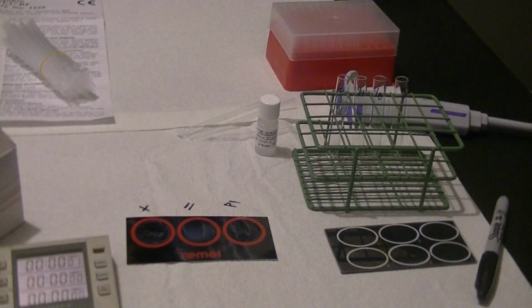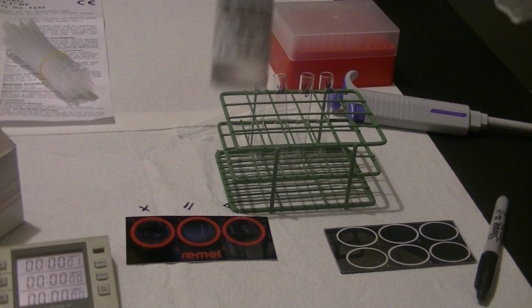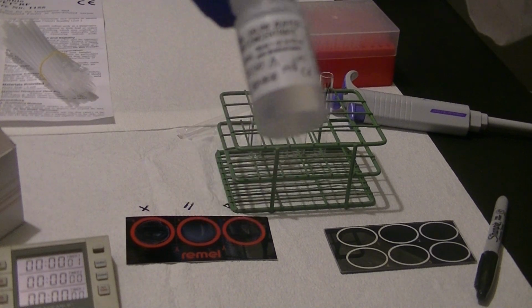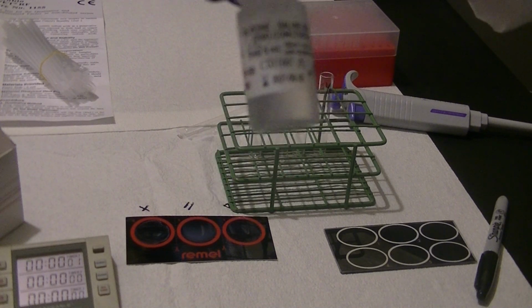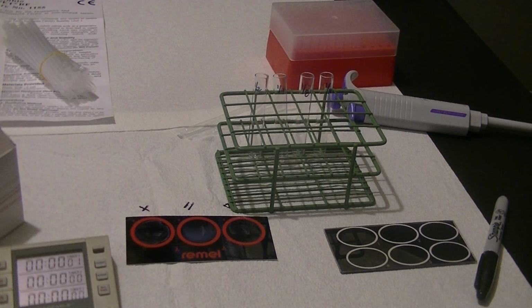I'm just going to move these out of the way so we can center that. This buffer that's included in the testing kit is specifically designed for diluting patient sample to repeat the test as a titer. I'm going to be adding 20 microliters of this buffer to each of the tubes.